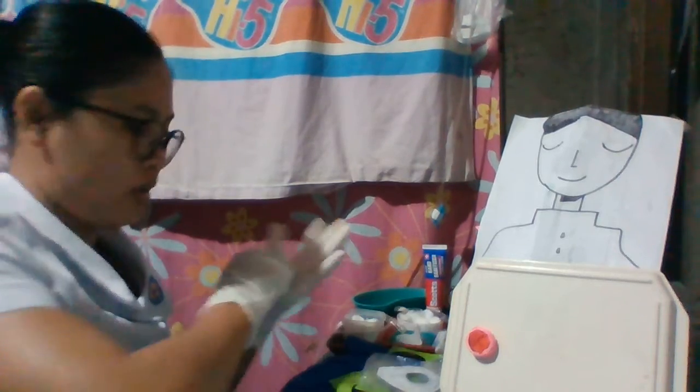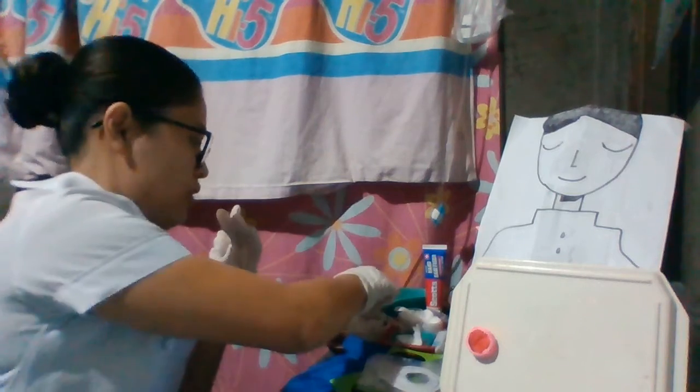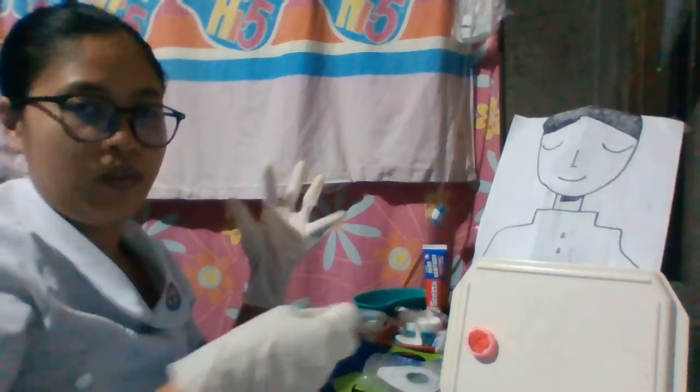Then we're going to wash the skin gently with skin cleanser or a washcloth soaked with mild soap.